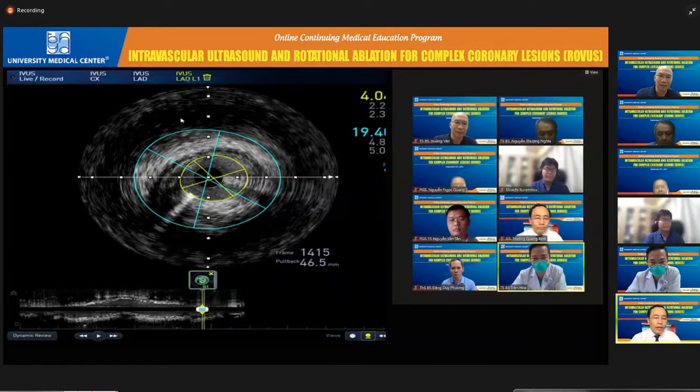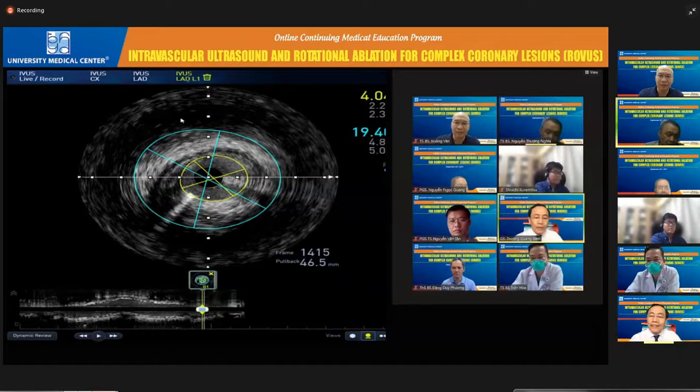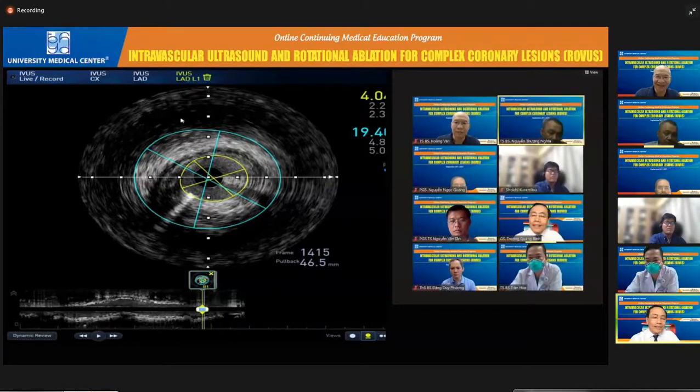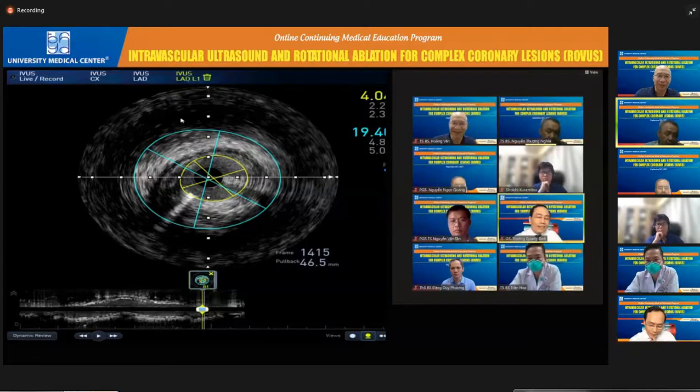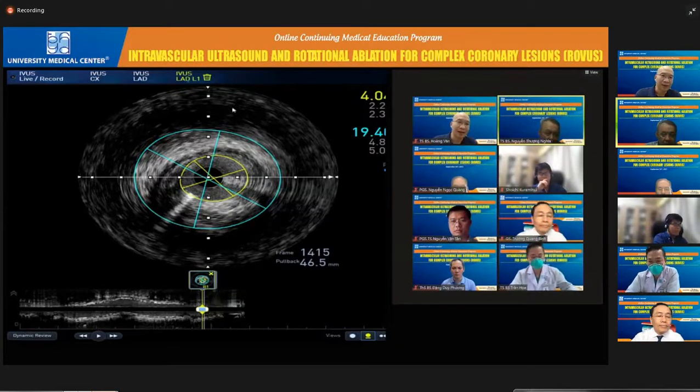Thank you, Dr. Trần Hòa. It means that you just use the stent from the LAD crossover to the left main, and then you can see what happened after that. And I would like to ask one question, Dr. Bình. Yes. Dr. Vũ, can you show us the IVUS of the ostium of the LAD and the ostium of the left circumflex before you decide the strategy for this patient?